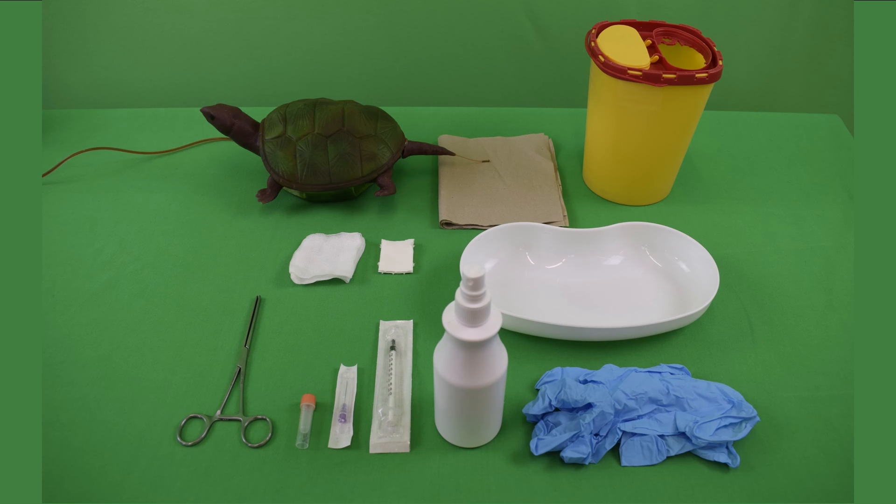Needed for this exercise and found in the clinical skills lab are an intestinal clamp, a lithium heparin blood tube, a 24 gauge cannula, a one milliliter syringe, disinfectant, disposable gloves, sufficient cellulose swabs, a kidney bowl, a simulator, cellulose, and a waste container.